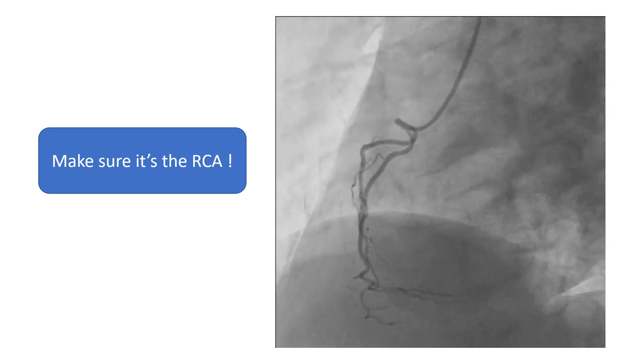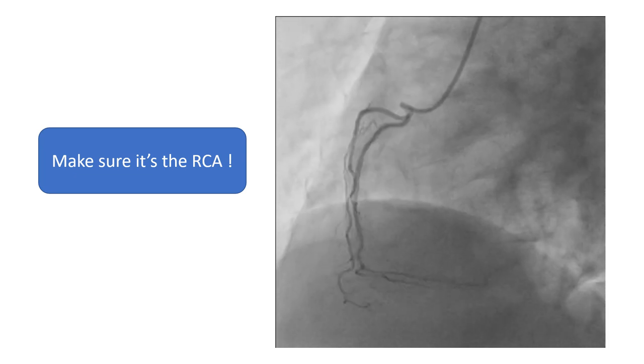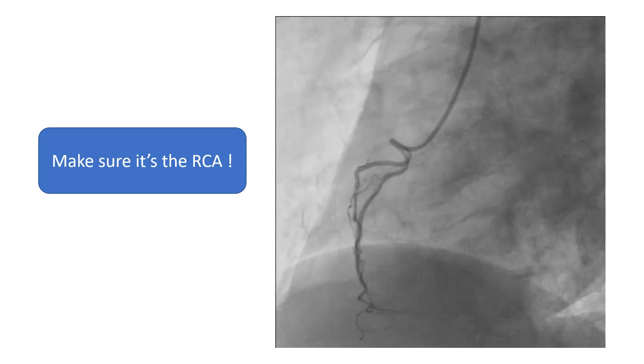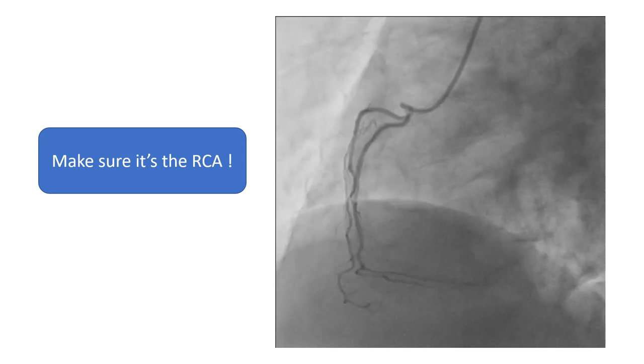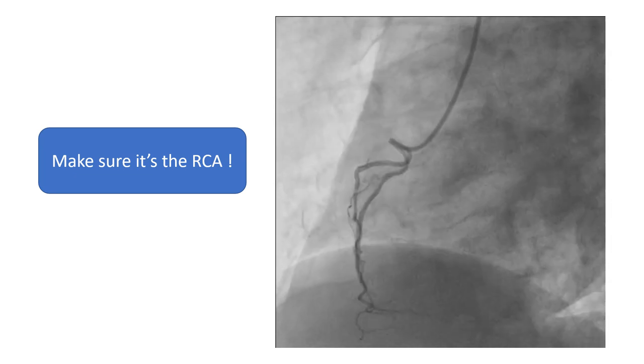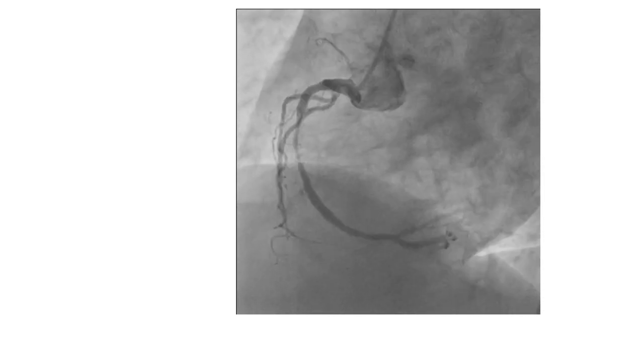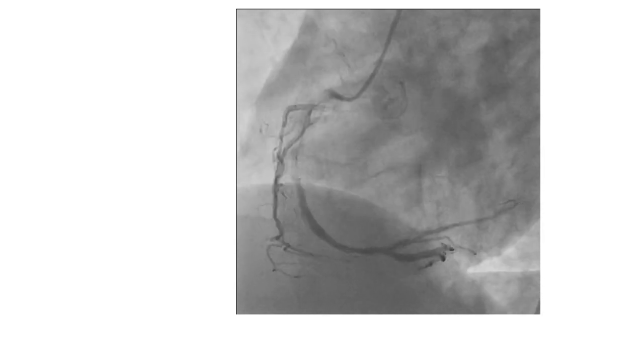This is an LAO view of the RCA. It was considered a non-dominant RCA. When you see that, make sure that the PDA is arising from somewhere else, usually the dominant circ, or is totally occluded. If not found, then you have to look for it, look for the proper RCA. This is the same case where angiography was done properly. The catheter was pulled back and the complete opacification of the RCA was seen.